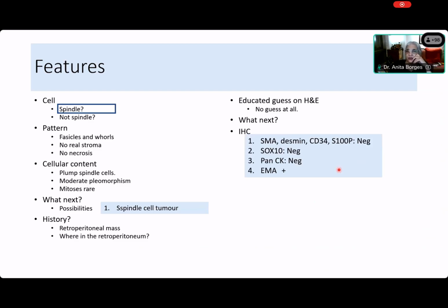All of this is negative except for EMA. So once again, is that a synovial sarcoma? What do you think, Kedar? Only EMA is positive, and there's no necrosis, very few mitoses. Is it a synovial sarcoma? Come on. No, ma'am. Why? Just based off this information. Not based on this information. But do you want to do the synovial sarcoma markers? No, ma'am. Why? Because there is pleomorphism. Kedar, if there is any pleomorphism at all, you do not want to think of a synovial sarcoma, right? So should we rule out a synovial sarcoma? No. It could be, but it's very unlikely because of the pleomorphism.